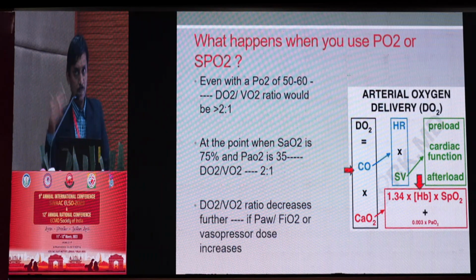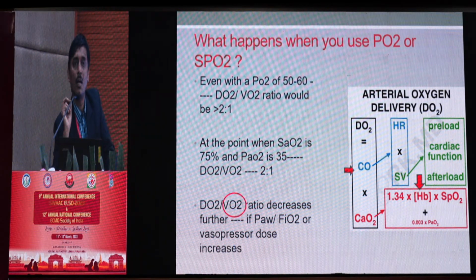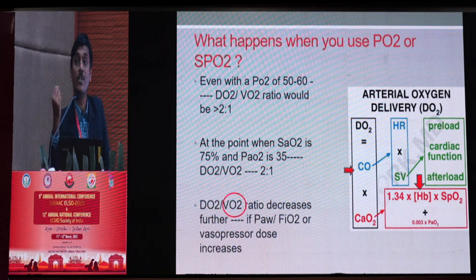The other thing is to see if you can increase the cardiac output. As Pranay rightly put it, additional cannulas might be needed. What's the third thing you can do? Essentially, see if you can cut down on your tissue demand for oxygen, and that's exactly what you do by cooling. While you do that, an additional measure is to make sure that the tissue doesn't go into anaerobic metabolism. So you need closer monitoring of your lactate and base deficit at that point.